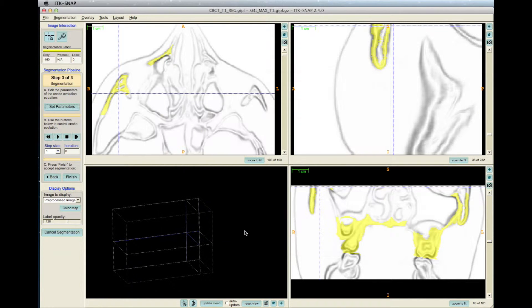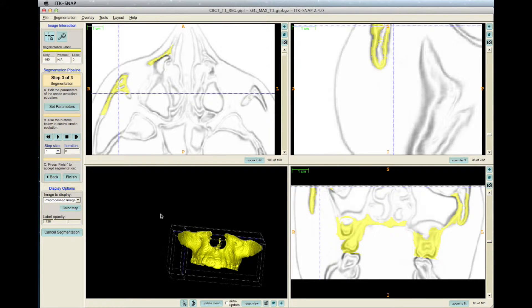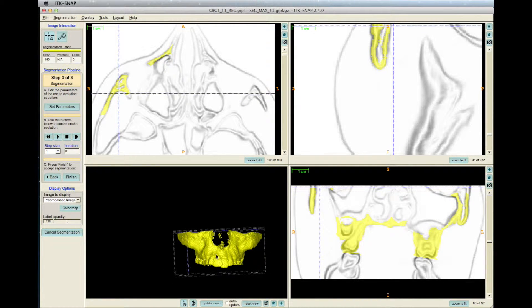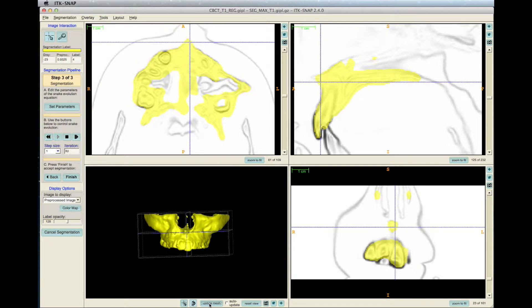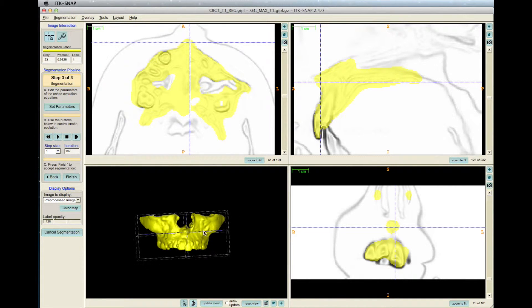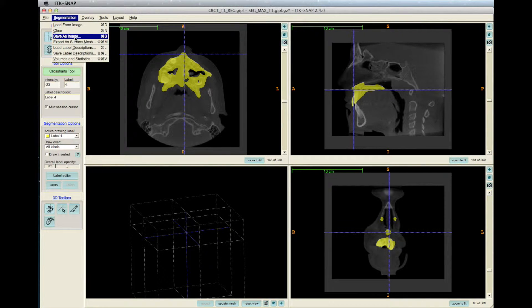Click Accept, view as you wish, then press Play to run the program. If you want to stop and see how the 3D model is coming along, click Update Mesh. After the maxilla gets thicker, click Finish and save the new maxilla segmentation by clicking Segmentation and Save As Image.